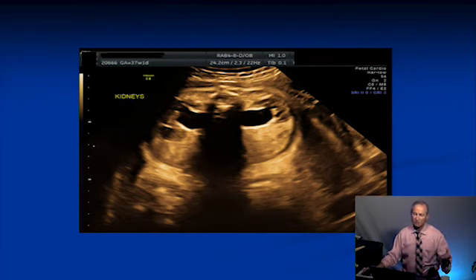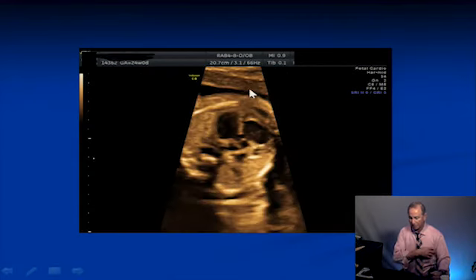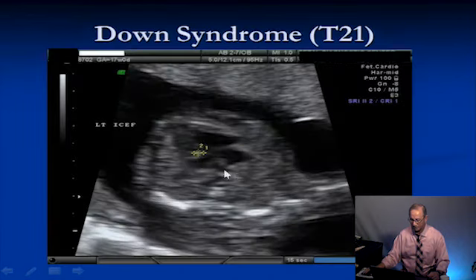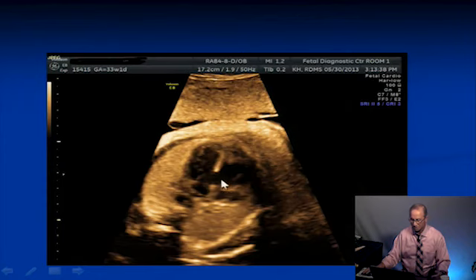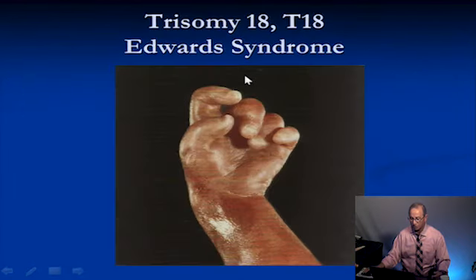To the opposite of that, if you have duodenal atresia or a cardiac defect, then there's a 30% chance that the baby has Down syndrome. It's the same baby, but we have a heart defect. We have what we call AV canal malformation here. See, the septum here is not going all the way down to the valve, so you have this big chunk of tissue missing. Intracardiac echogenic focus. Here's AV canal again. Double bubble sign.